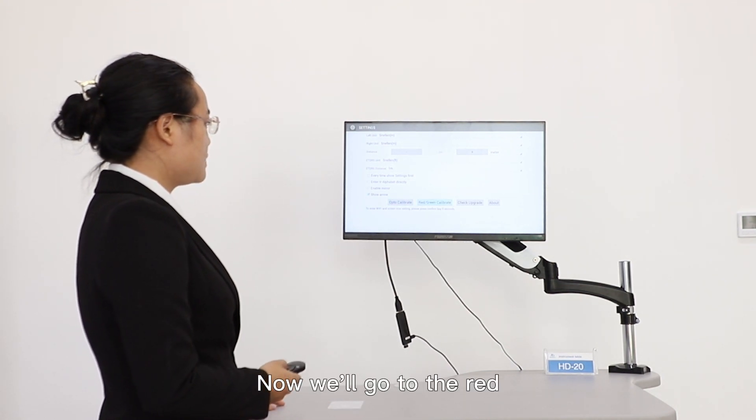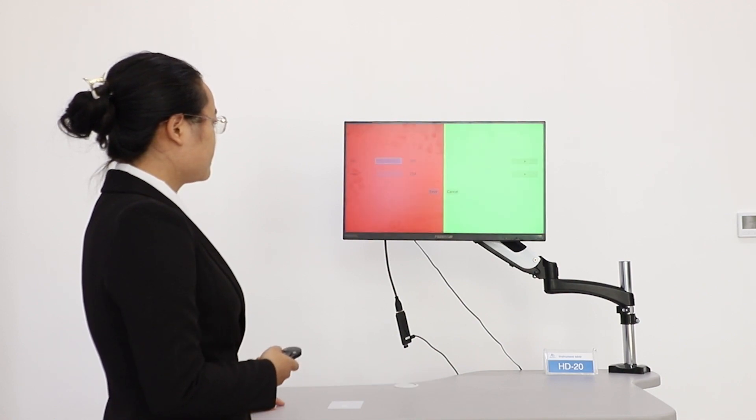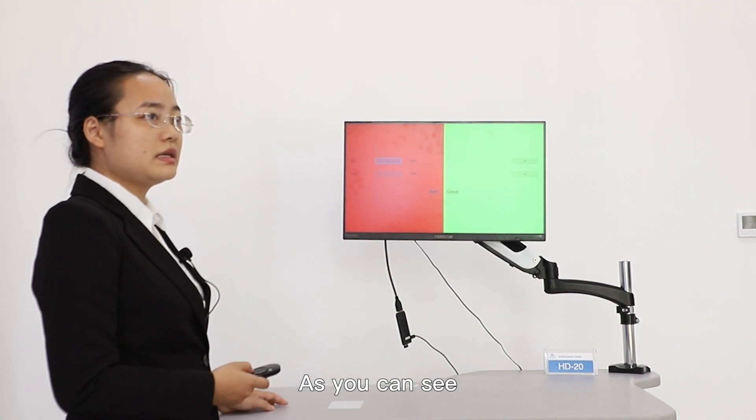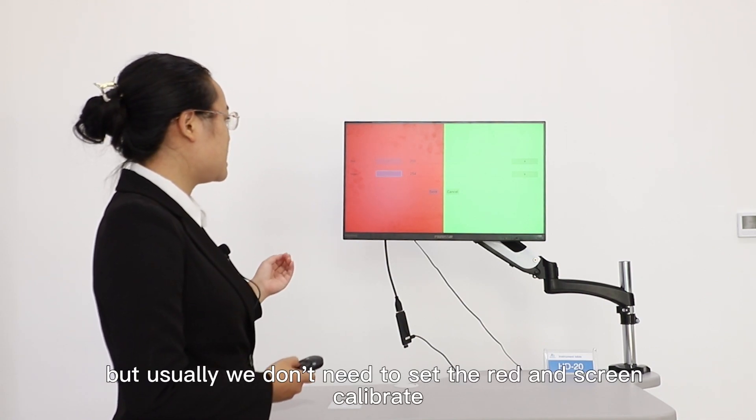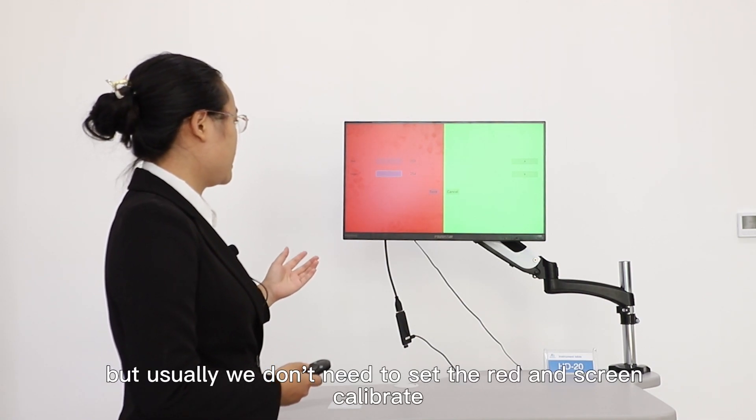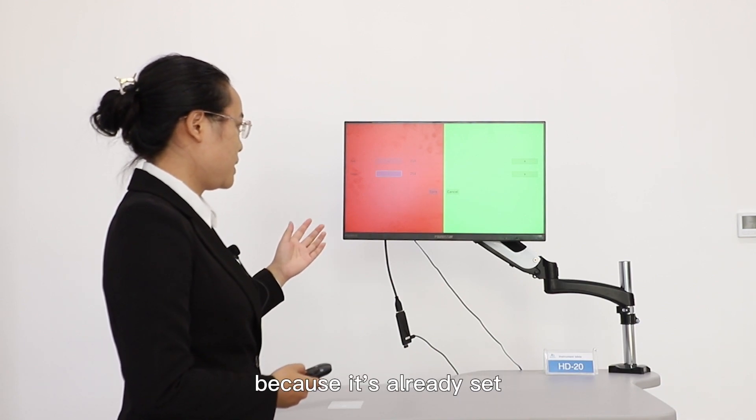Now we will go to the red-green calibrate. As you can see, it can be set. But usually we don't need to set the red and green calibrate because it's already set.